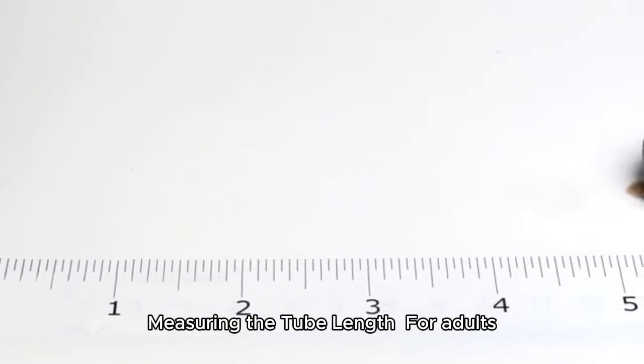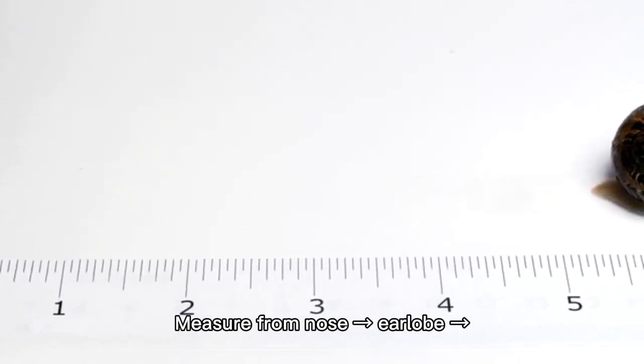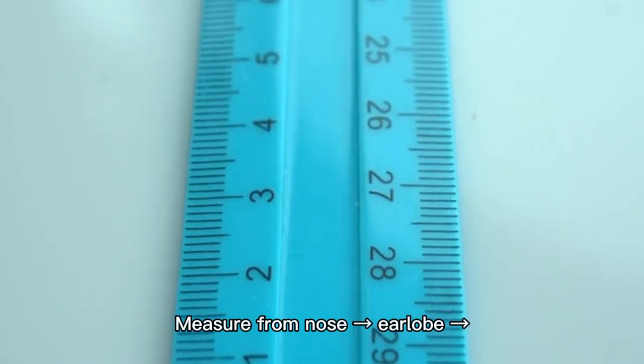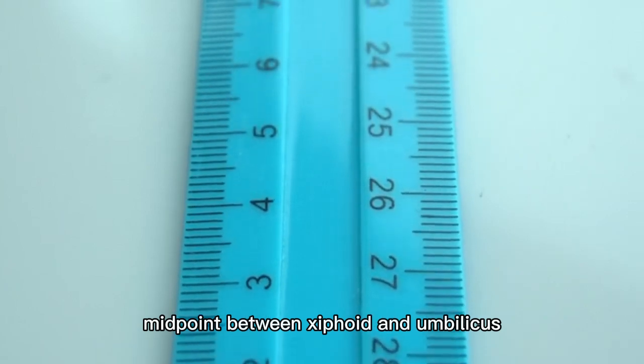Measuring the tube length. For adults, measure from nose to earlobe to xiphoid process. For infants, measure from nose to earlobe to the midpoint between the xiphoid process and umbilicus.